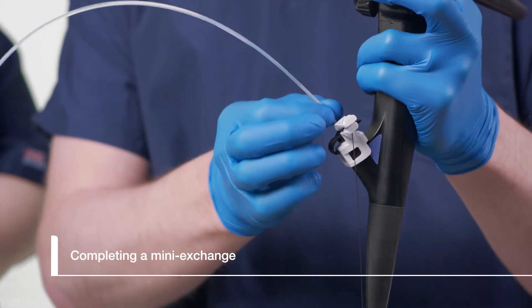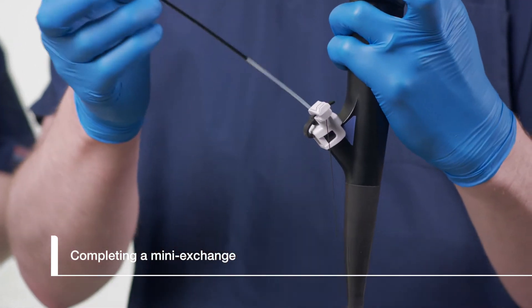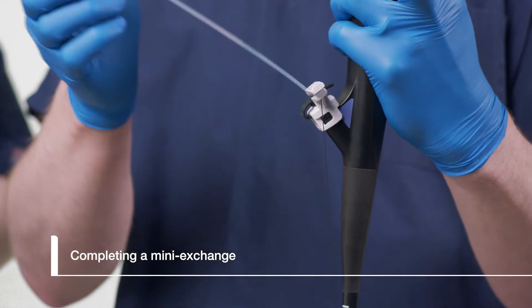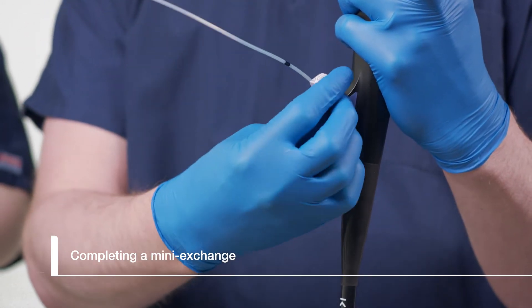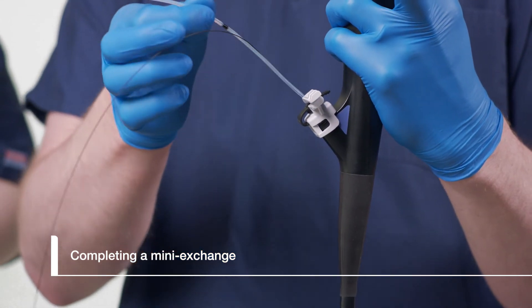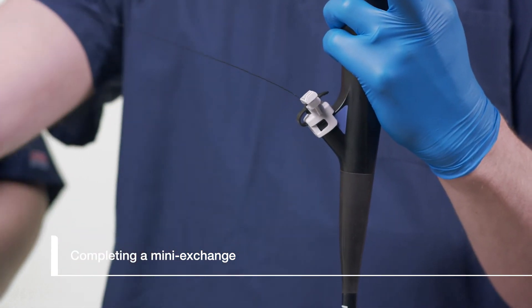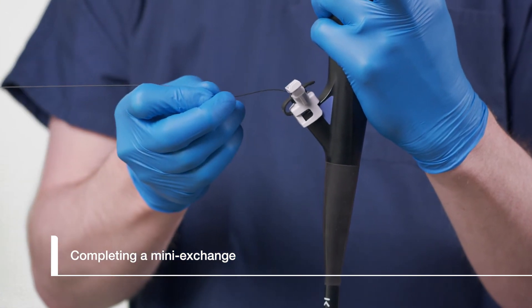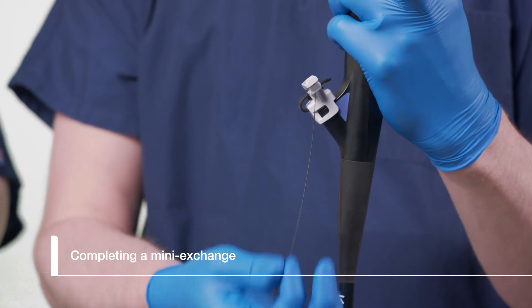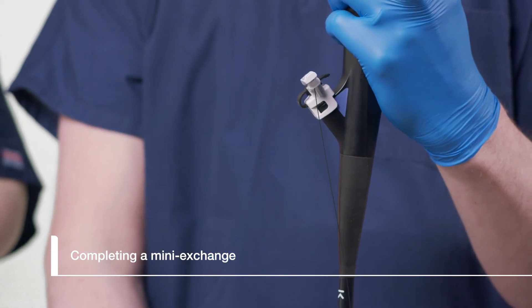Once the guide wire is locked, the sphincteratome catheter may be withdrawn until the first C-channel marker reaches the locked guide wire. Unlock the guide wire by reversing the locking motion. It is recommended to secure the guide wire using the V lock on the duodenoscope elevator. Continue withdrawing the sphincteratome until it clears the biopsy cap, and then lock the guide wire in CleverLock once again.